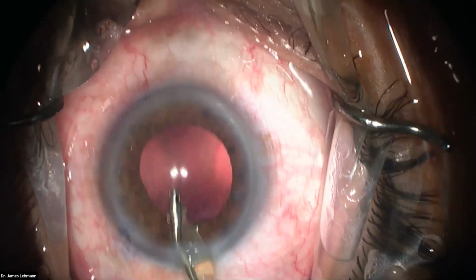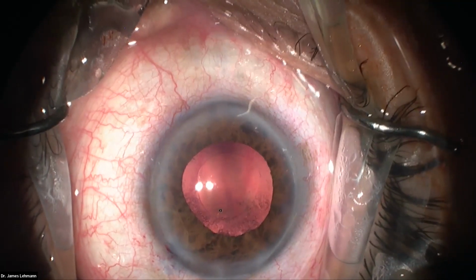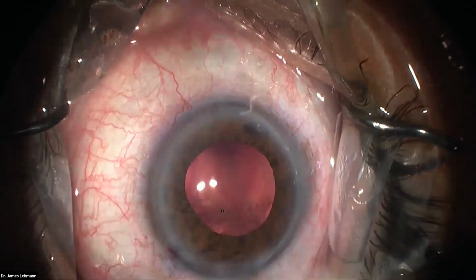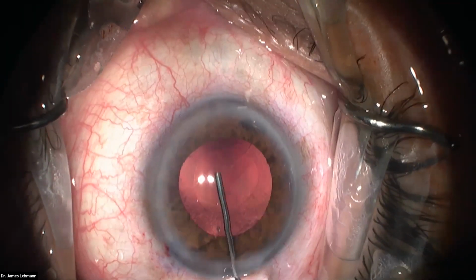That's another choice. So you saw me grab the capsule there, but I then moved away. So we'll go and put the lens in. So I'll get the viscoelastic. Now this is a cohesive viscoelastic. It doesn't have that protection over the cannula, so I'm grabbing it here so that cannula doesn't go shooting around. So we're filling the whole front part of the eye, now expanding the capsule.